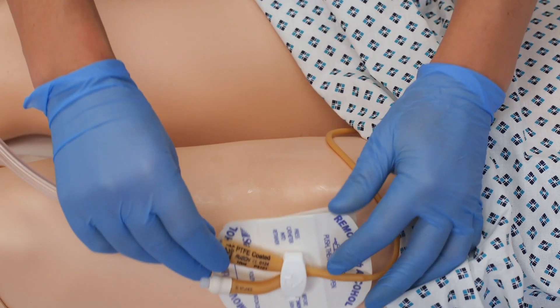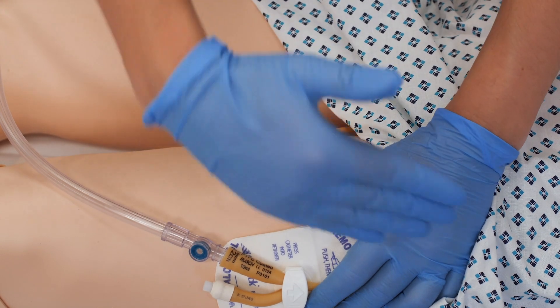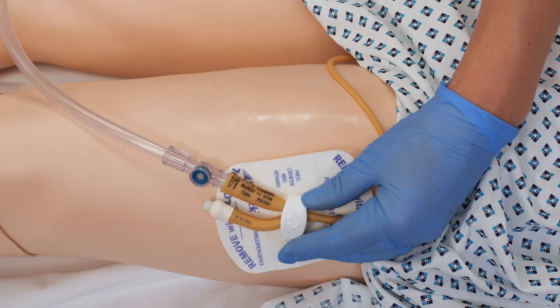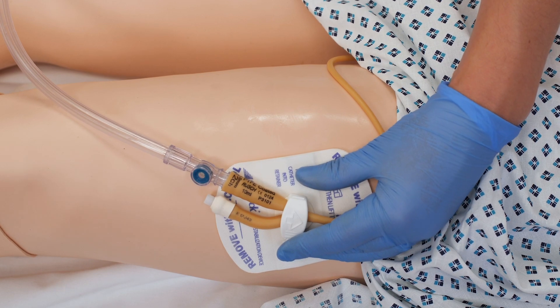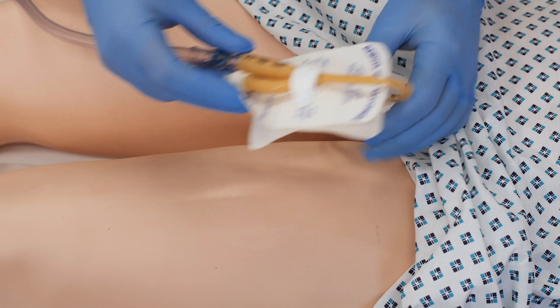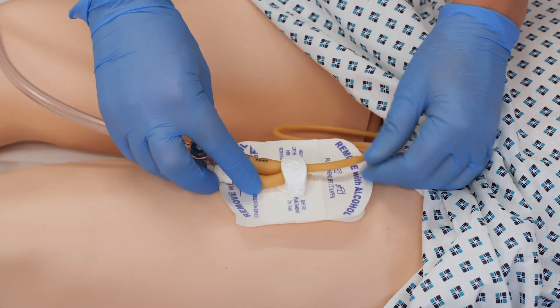Likewise, on the outer side, as patients are positioned over on that side, there's a risk of causing damage. So that's dry now and we're going to pop this on top of the leg.